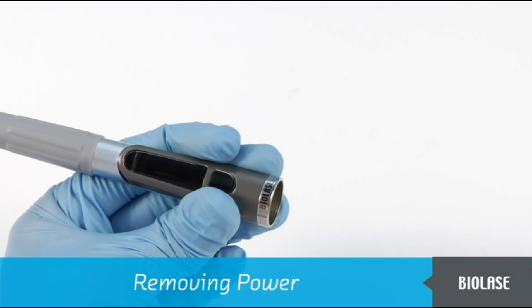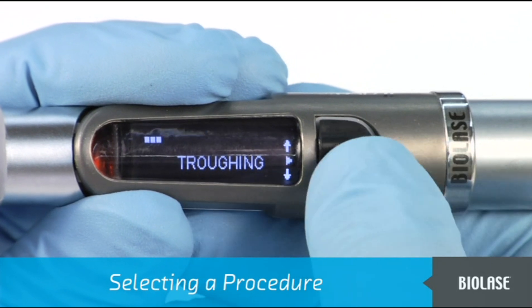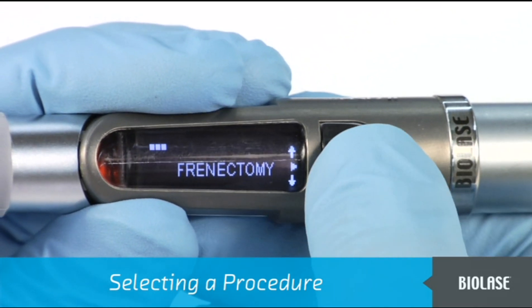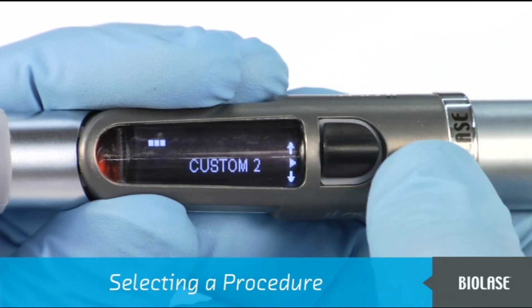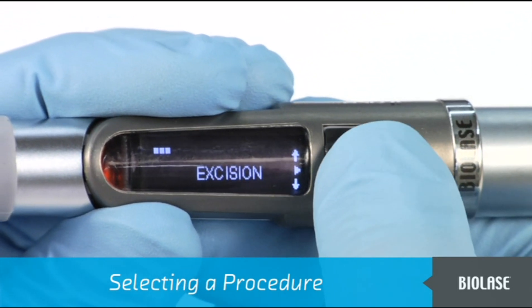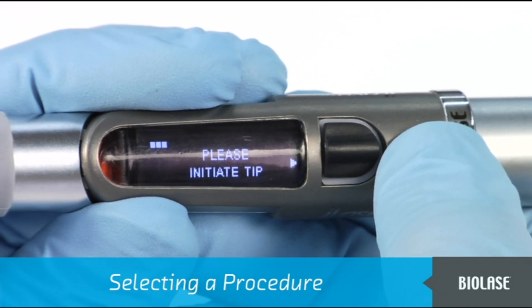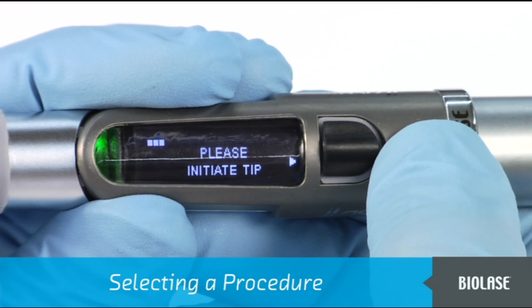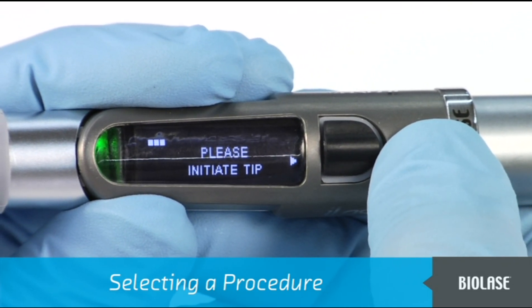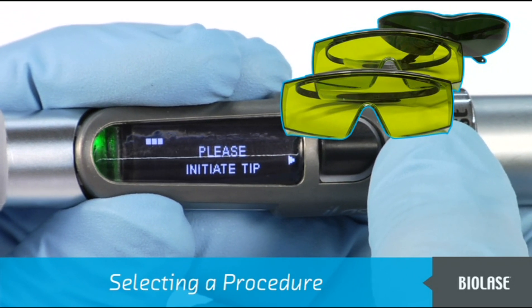The iLaze has ten pre-programmed procedures and two extra custom procedures. Scroll through the preset names using the black navigation button — up or down — and then select your choice by pressing in. After selecting a procedure, the LED will turn green and the red aiming beam will come out of the tip. The iLaze is now in ready mode, and pressing the finger switch will activate the laser. Please ensure that everyone in the room is wearing the appropriate eye protection.